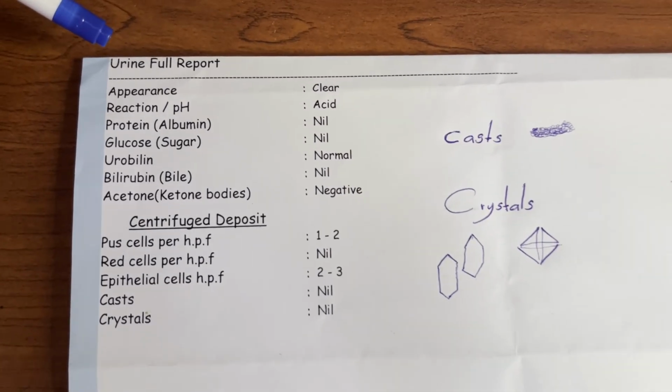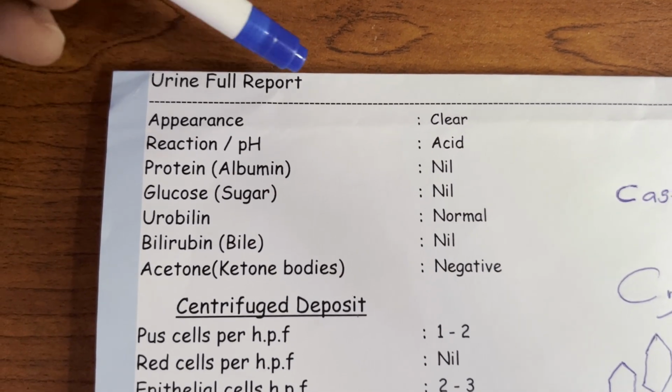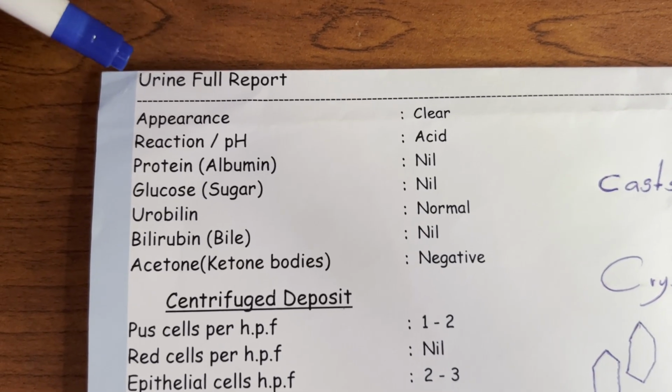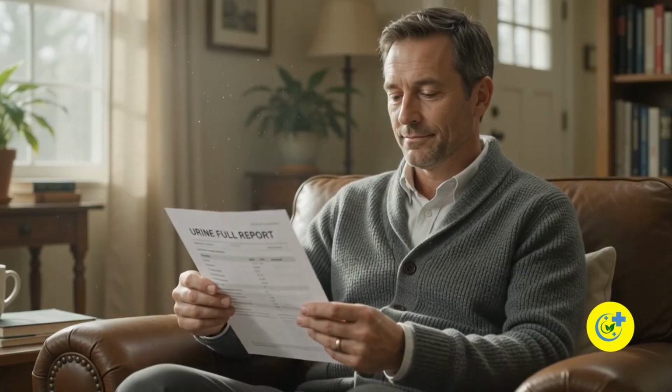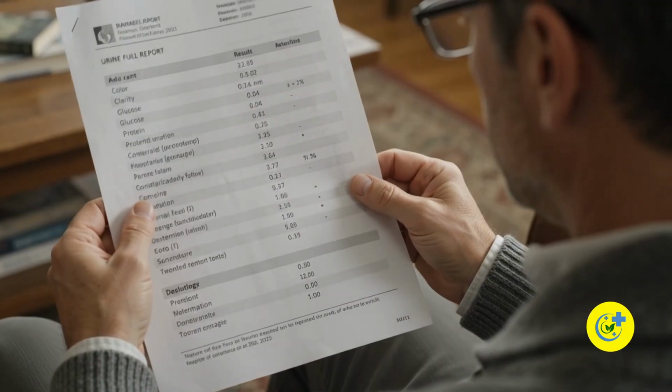Take a look at this document. This is a standard urine full report. Instead of guessing what these numbers mean, we are going to break down every single line from A to Z. Make sure you watch all the way through to the end, because by the time we finish, you'll be able to pick up any urine test report, read it line by line, and understand exactly what it reveals about your body.